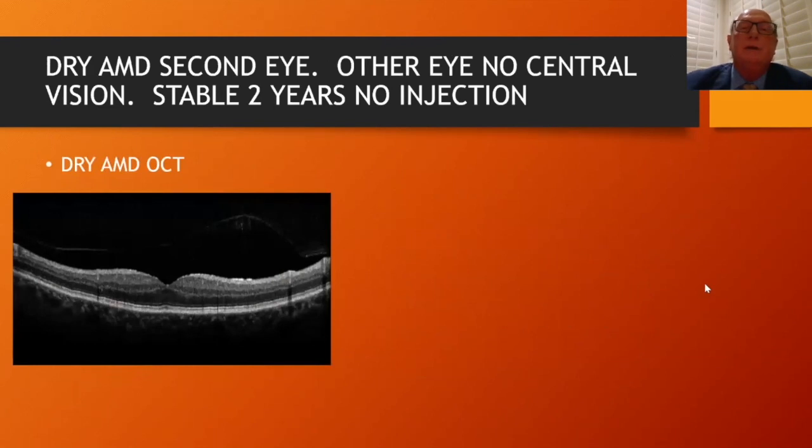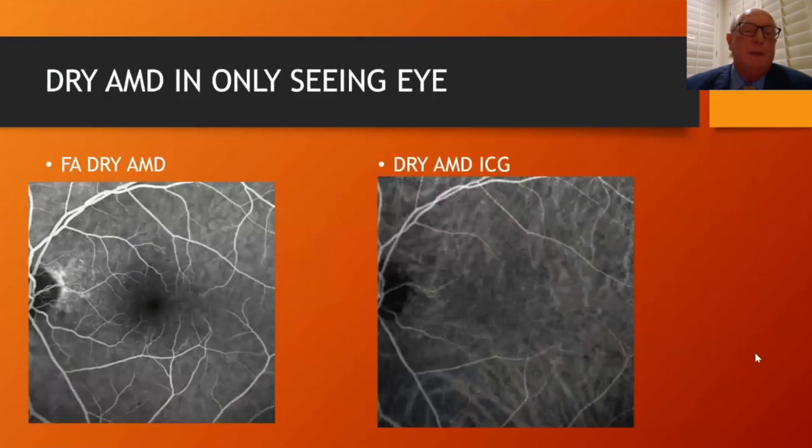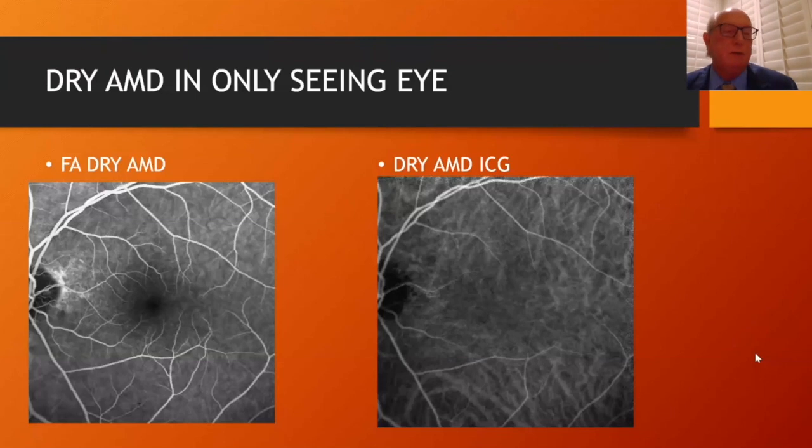Dry AMD, the second eye of those with wet, very important. If I see patients with significant findings on the OCT of damage to the pigment cells and symptoms, and the angiogram here shows some scattered changes at the pigment epithelial cells, the ICG is probably unremarkable. These patients will have a good response again to MicroPulse laser. You do the quarterly treatments. All patients are told that this is a treatment that is well established.